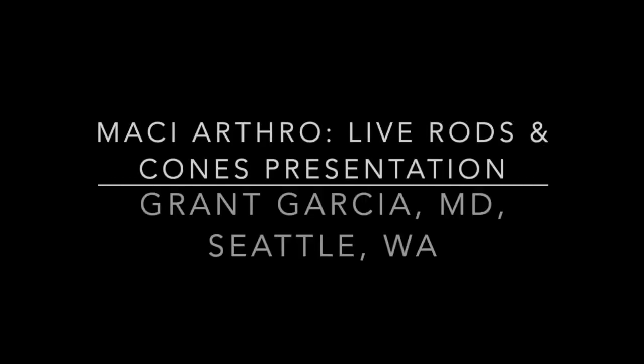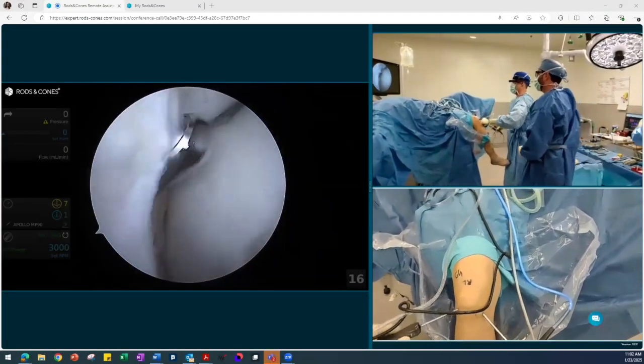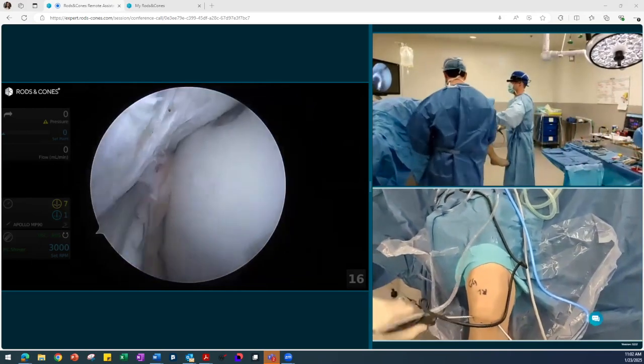This is a presentation of a live MACI Arthro for a trochlea defect. This is using the new rods and cones video system. So you can see both the intraoperative as well as the outside of the knee view.